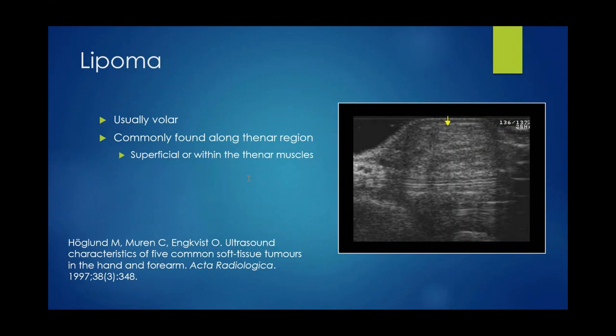I would align the transducer with my target joint, traditionally directly underneath the transducer, and then find a window where I could put the needle in that region, preferably without going through a tendon, and then down into whichever recess I'm targeting.